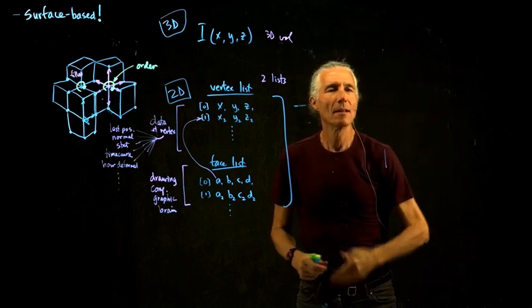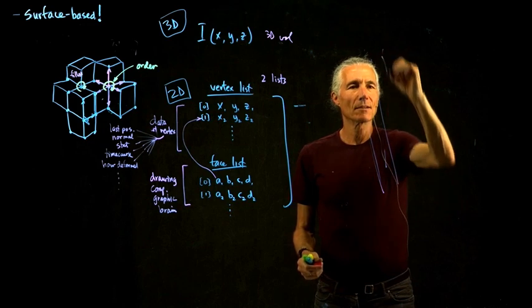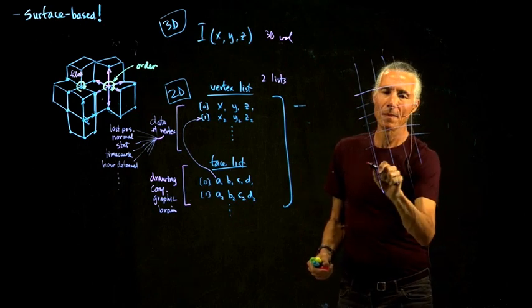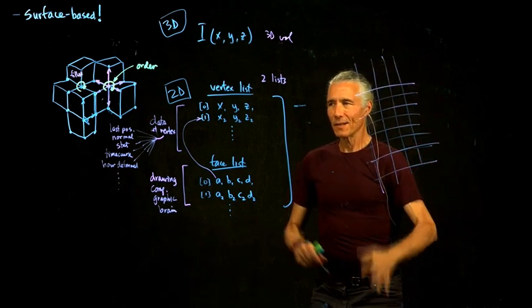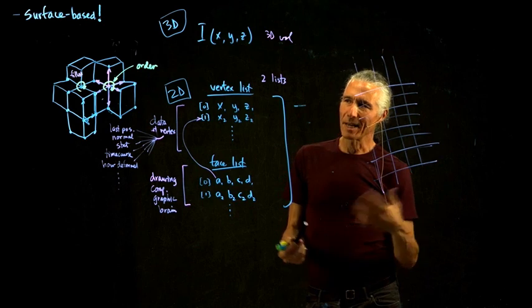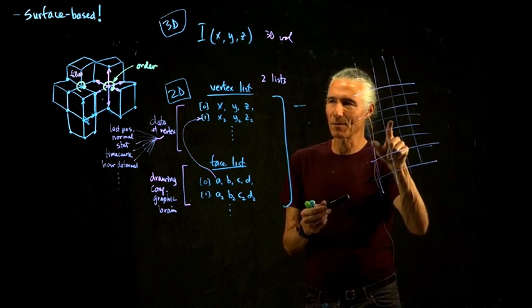So here's a 3D block of functional statistics. We've taken our time course, did the whole nightmare that we did in the previous lecture, and we came up with an F ratio. So we calculated the F ratio for a voxel.